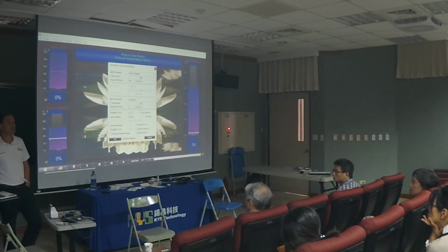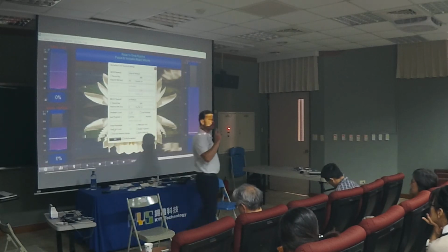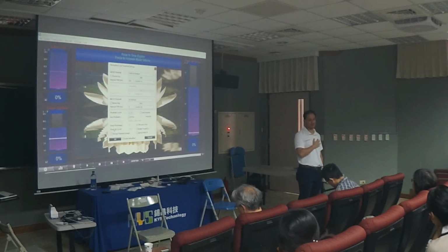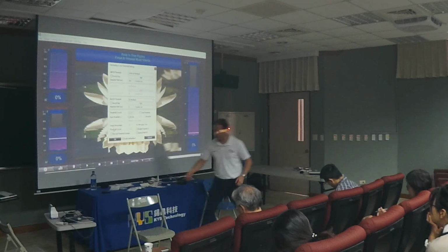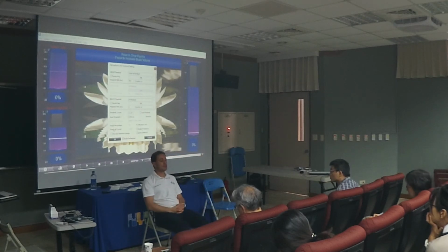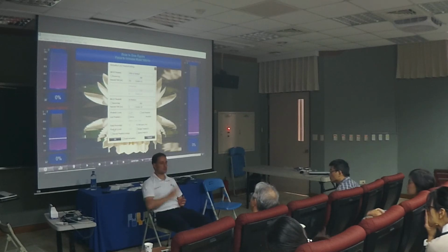All right. What you want to do before every session, I recommend that you do a 1 minute baseline. Before every session, do a 1 minute baseline. So the client comes and sits down, you put the sensor at CZ, and you tell the client, okay, please sit still. I'm going to do a baseline for 1 minute, 1.5 minutes, because sometimes you're going to have a little bit of noise. So for 1.5 minutes, they're sitting there looking at the screen and nothing's happening, and you record baseline.